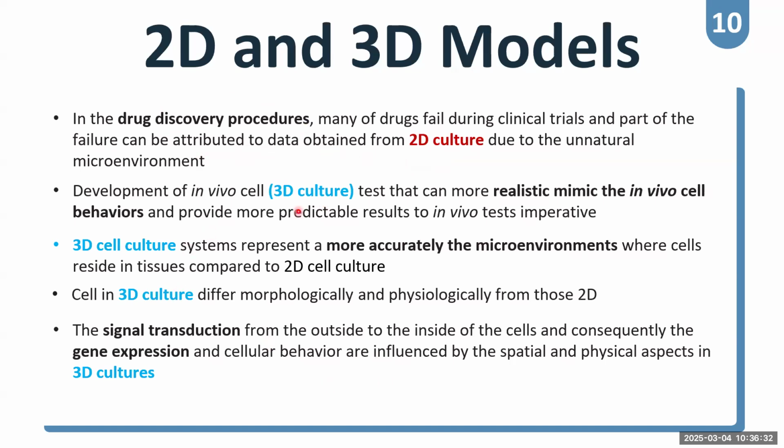Another thing I can say is that 3D cell culture more realistically mimics in vivo behavior. It is more aggressive, with the tumor microenvironment. And there are now publications saying that 3D cell culture carries 99% to 100% of the signaling transduction or gene expression profile of the original tumor in the patient.